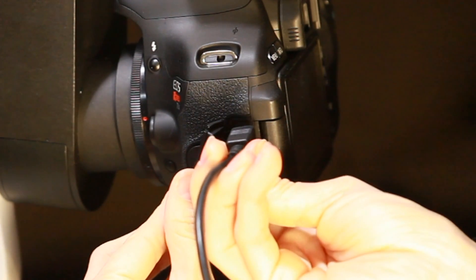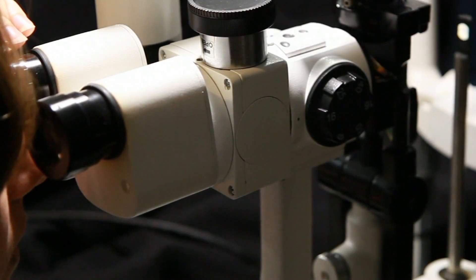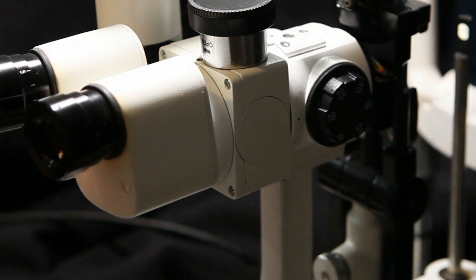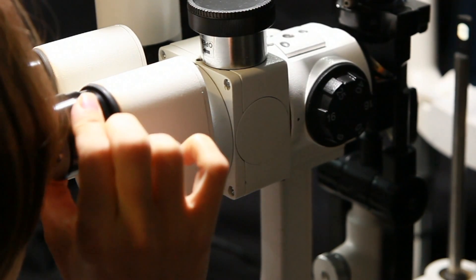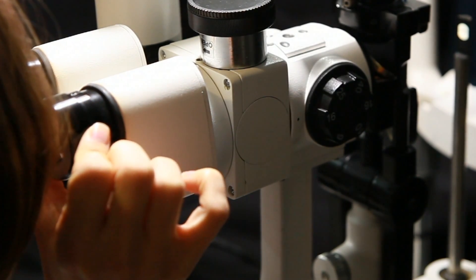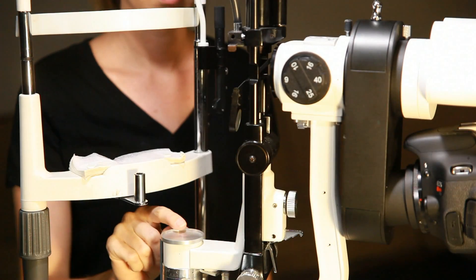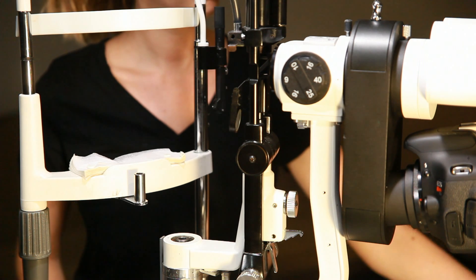We now connect the USB cable to the digital camera. Now remember to focus the eyepieces of the slit lamp monocularly with the slit lamp focus bar that comes with your slit lamp. Finally, we install the background illuminator to the slit lamp and use a wire tie to keep it stable.